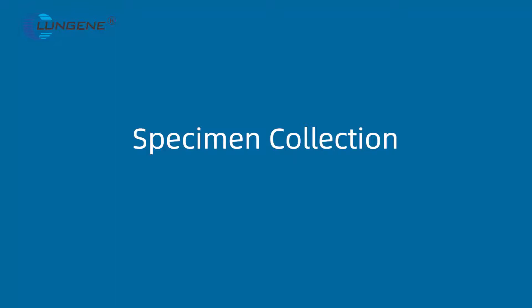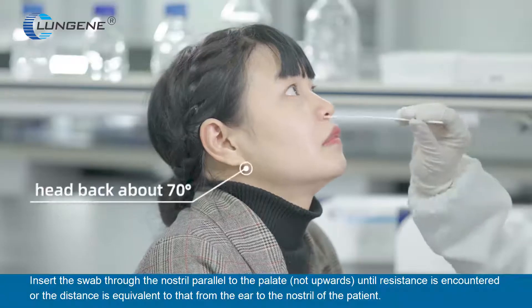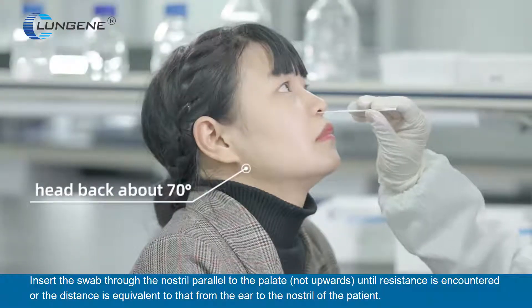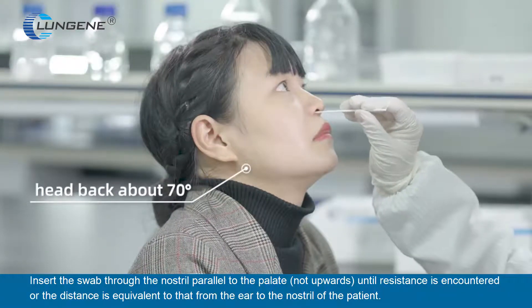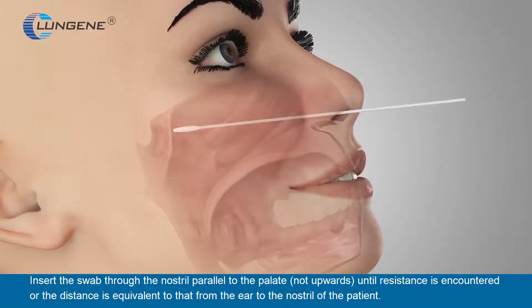Specimen Collection: Use the sterilized swab supplied in the kit. Insert the swab through the nostril parallel to the palate — not upwards — until resistance is encountered, or the distance is equivalent to that from the ear to the nostril of the patient.